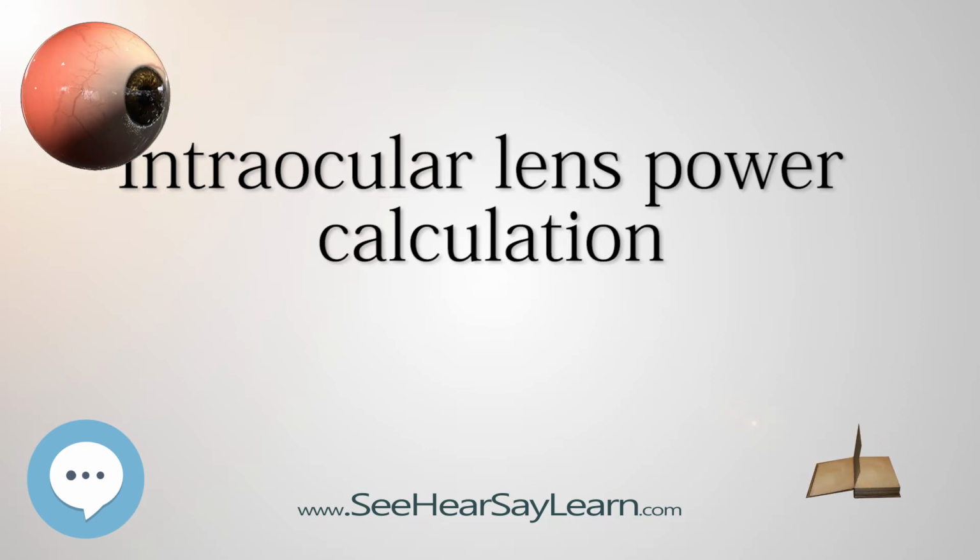The difficulty arises from several factors. The instruments used by ophthalmologists to measure the corneal power, keratometers and corneal topographers, cannot obtain accurate measurements in eyes that have undergone corneal refractive surgery. Most manual keratometers measure at the 3 mm zone of the central cornea, which often misses the central flatter zone of effective corneal power. The assumed index of refraction of the normal cornea is based on the relationship between the anterior and posterior corneal curvatures. This relationship is changed in LASIK eyes.